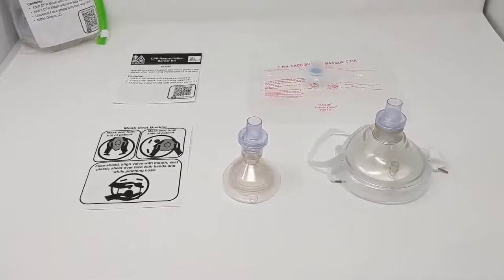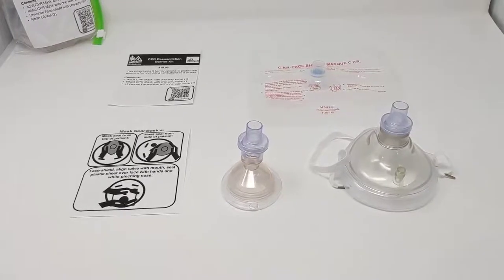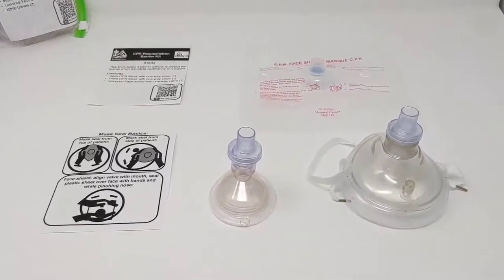This is our CPR resuscitation barrier kit. This kit includes all the barrier devices that you may need to use for delivering CPR with ventilations or assisted ventilations on their own.